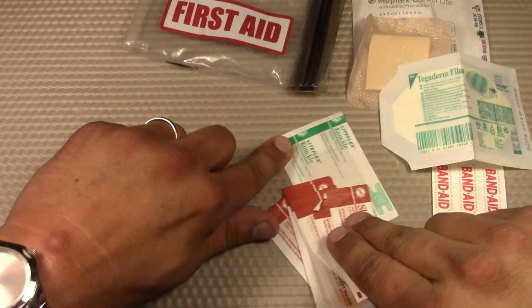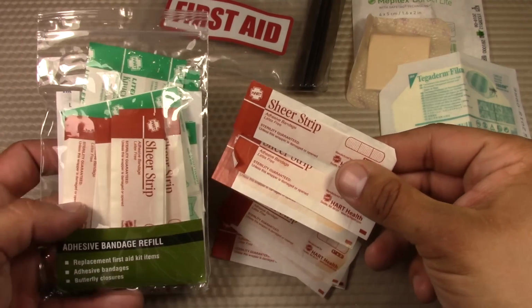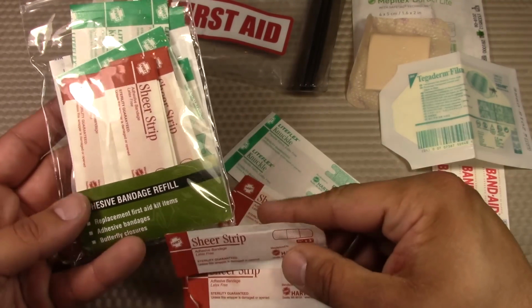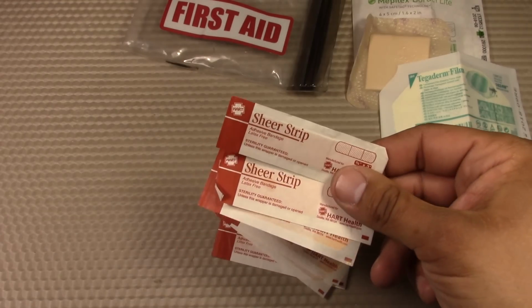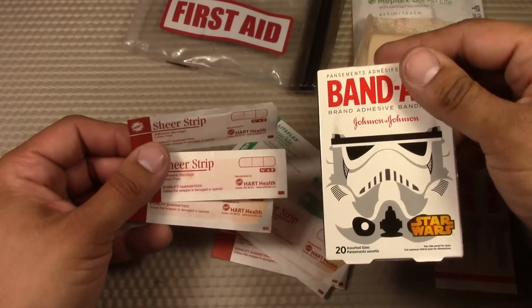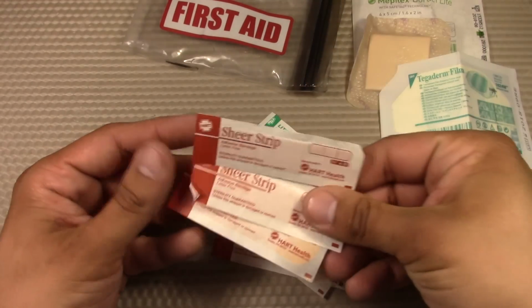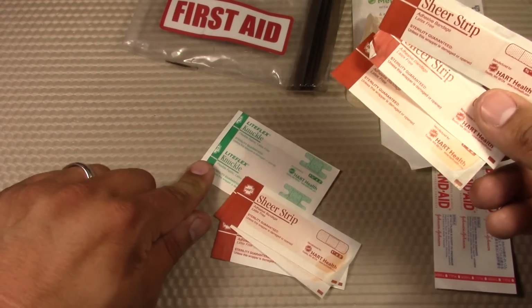Next, I include several different Band-Aids. So the particular Band-Aids that I've been using in my kits are the ones that you could get from REI. I usually get them in one of these adhesive bandage refill kits. And I usually keep several in there, and oftentimes I'll also include some kid-friendly bandages just because they look a little cooler for the kids. So some single bandages. I also include one knuckle bandage.